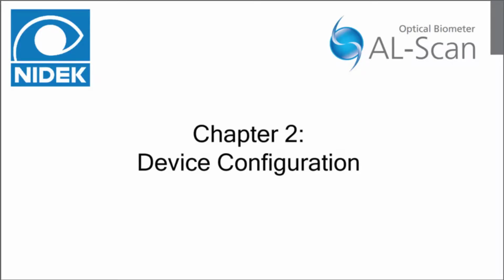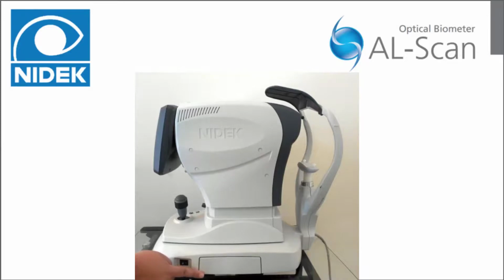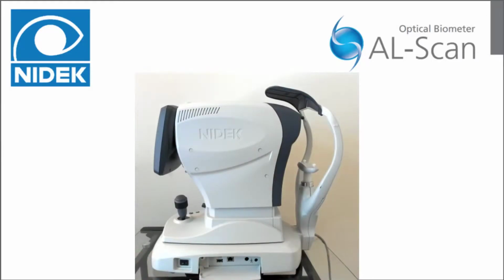Chapter 2, Device Configuration. Here is a right side profile of the AL Scan. The black power switch is located on the base of the device. To turn it on or off, flip the switch. It is safe to turn the machine off using this switch without any shutdown procedure. The side panel is located next to the power switch. Open it by pushing down on the tab in the lower left corner.